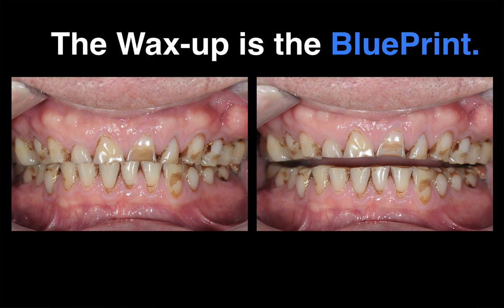So you look at the different views. Here he is before. Again, end-to-end occlusion from the wear and the movement of the teeth as the teeth wore. He developed more of an end-to-end occlusion as opposed to any kind of overjet and overbite. So we're going to open the vertical to create a bit of overjet and overbite. So he has a more normally functioning occlusion, and it helps with obviously the survival of our restorations, as opposed to having our restorations into an end-to-end occlusion.